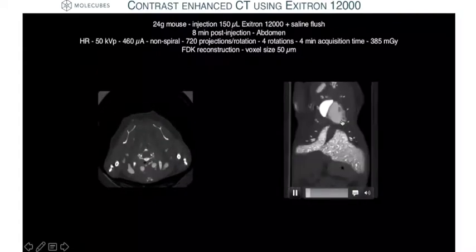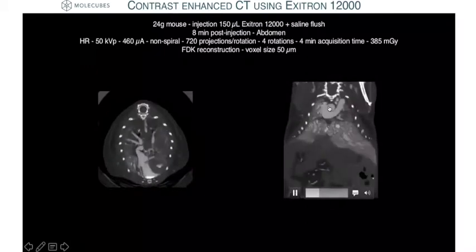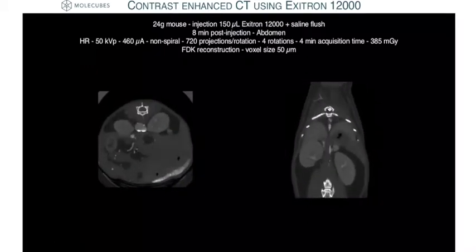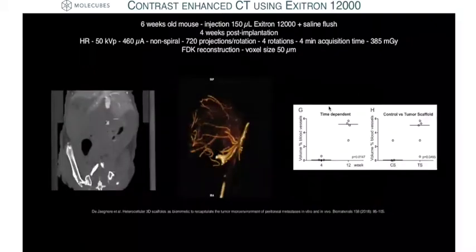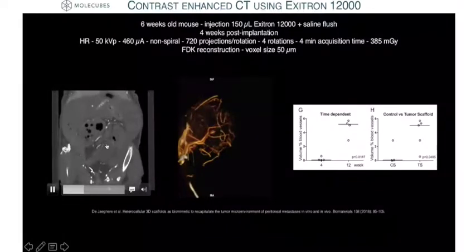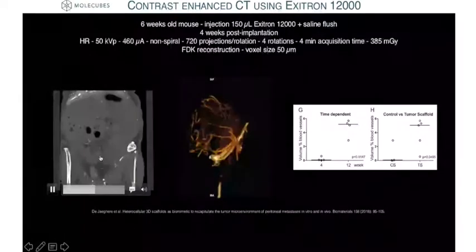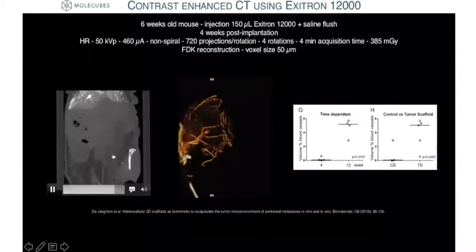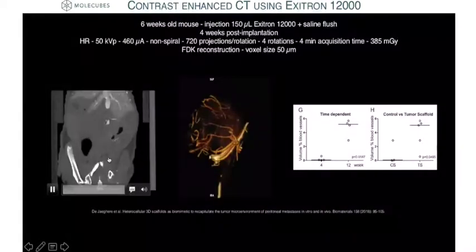And also, of course, you very nicely see on top here the region of the hearts. So if we look at these images, we were pretty convinced that we should see, in fact, angiogenesis in the scaffolds. And the results can be seen here on this slide. So the scaffold is positioned here. And if you look very carefully, sometimes you see really blood vessels running into the scaffolds.